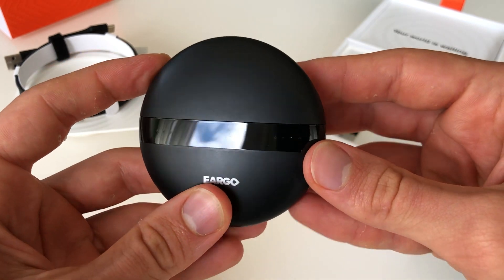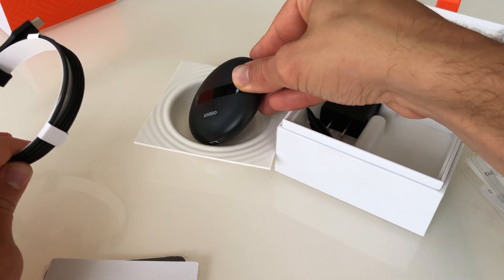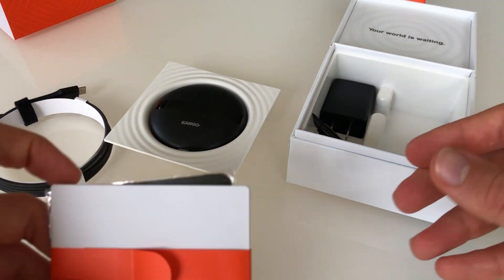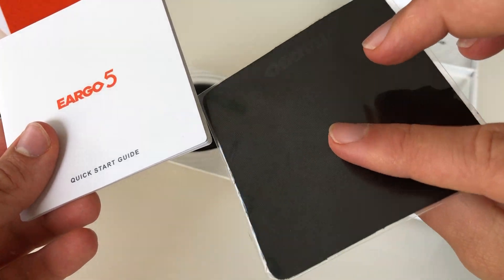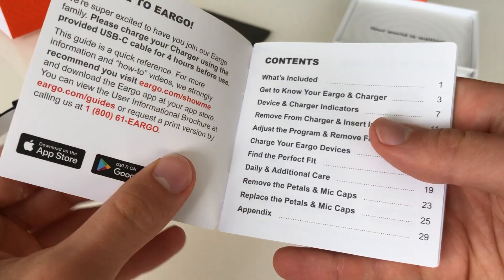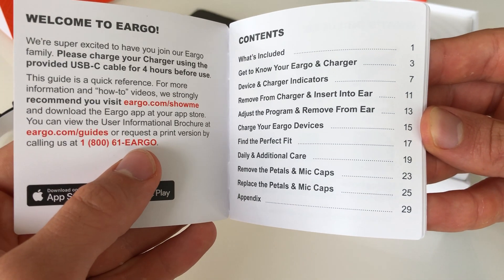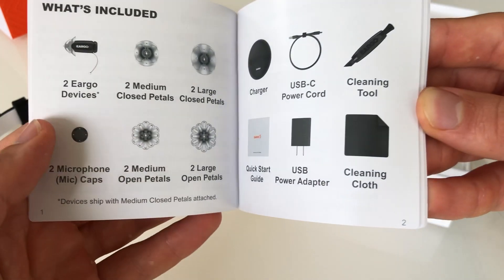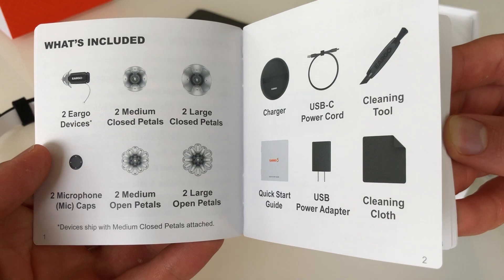Let's put that to the side and review what comes in this quick start guide. Contents — what's included, getting to know the charger, removing it, inserting it — all these important tools. You can see here all of the pieces that I just showed you.